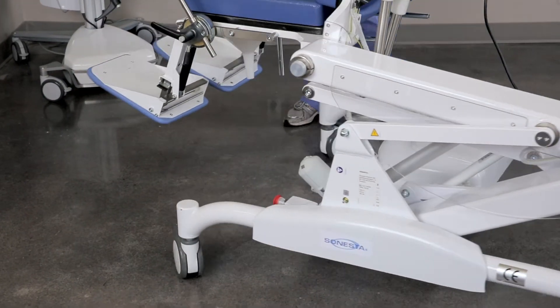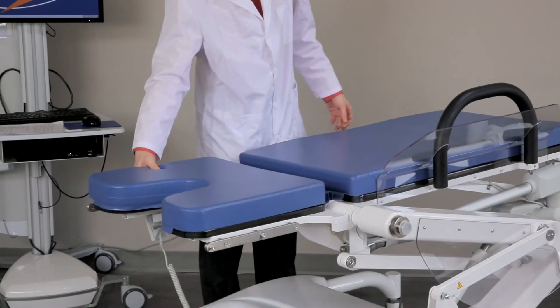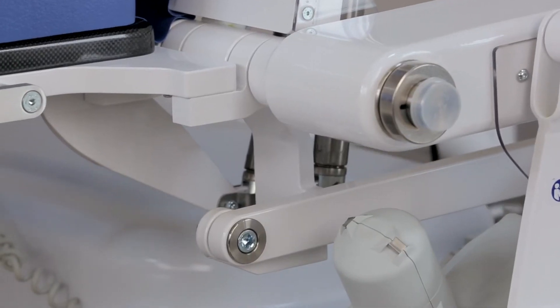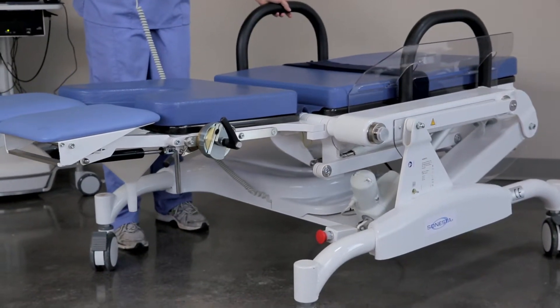Four double-wheel locking casters offer unencumbered maneuverability, ideal for bariatric patients or those with restricted mobility. The 6210 can support up to 250 kilograms or 550 pounds.